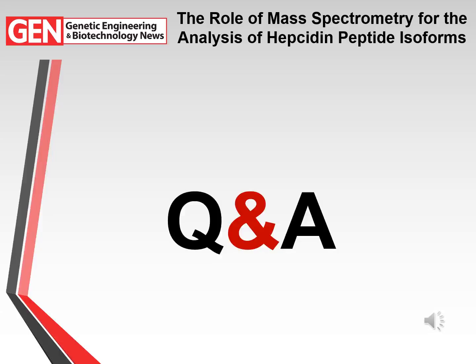The other thing that's important is making sure that we are able to analyse things in a timely manner. It's a very good point to make now: we see Hepcidin as being part of the armoury of biomarkers that clinicians would typically use. If it's going to be utilised readily, we need to be able to do very fast measurements. So the challenge as we move forward is that we need to be able to get a sample and have an answer back for a clinician within an hour. And that's one of the things we're focusing on now. So for the medical community to really take advantage of this, we've got to take that next step so we can turn things around quickly, and that's one of the projects we're working on at the moment.